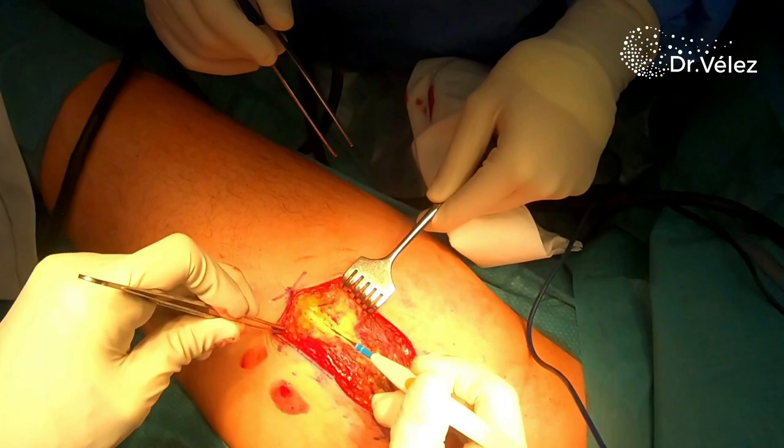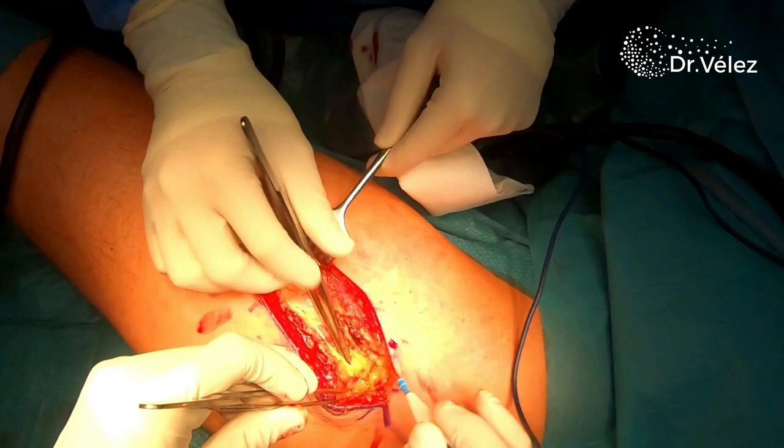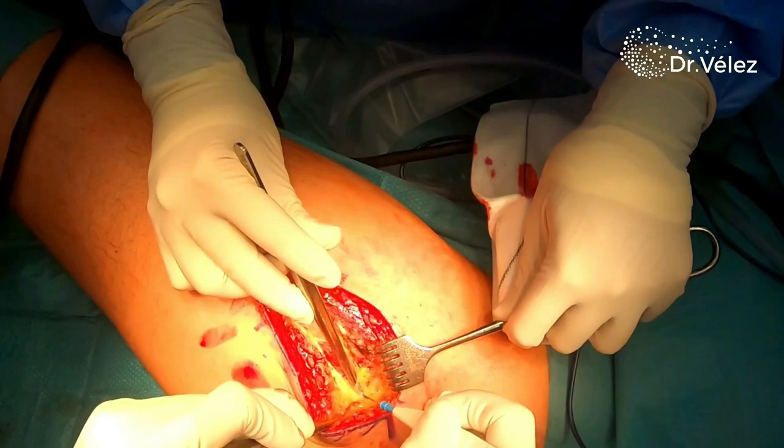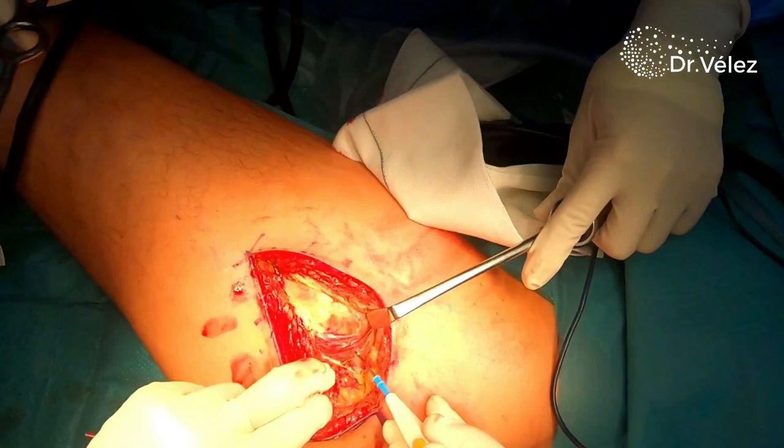In the proximal third of the incision, you start finding fibers of the gluteus maximus, which I also open up with electrocautery and soft opening with my own fingers. We then arrive to the bursa of the greater trochanter, which we also open up and remove posteriorly with a gauze.